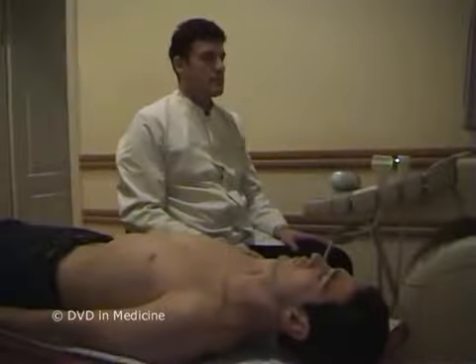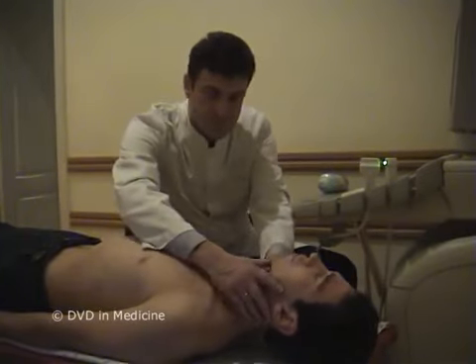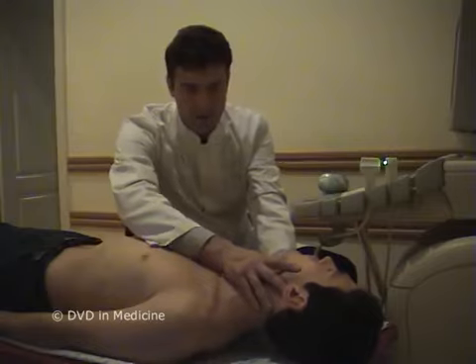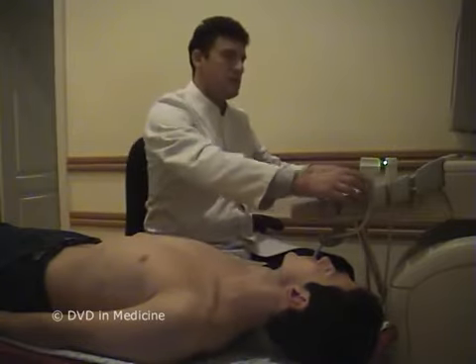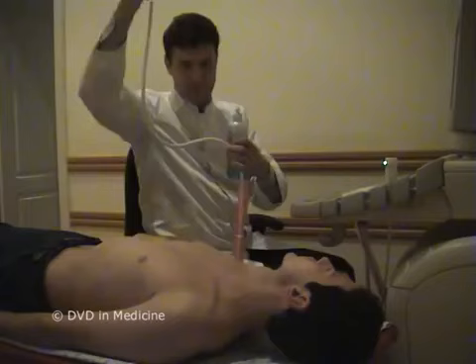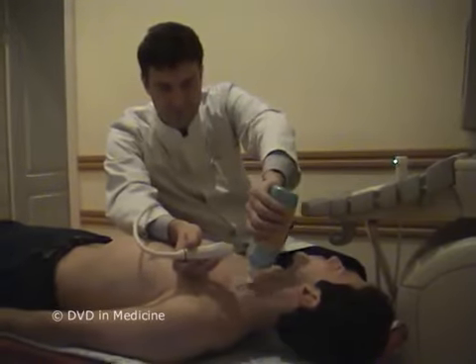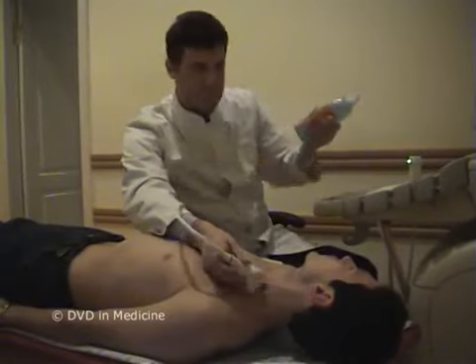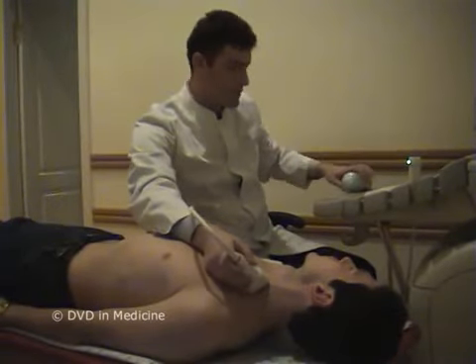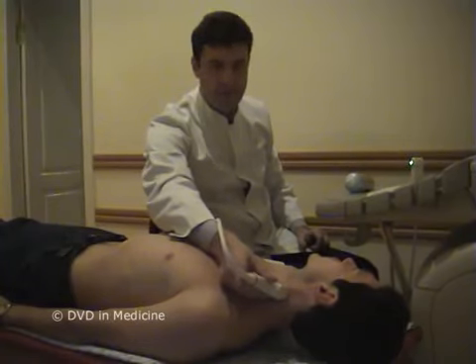The patient position and ultrasound approaches. One starts the scanning of the carotid arteries with the patient in the supine position with their neck a little extended by placing a pillow under their shoulders. The patient's head should be turned 45 degrees to the side, facing away from the arteries under investigation. The patient should be comfortable, avoiding any excessive extension of the neck.